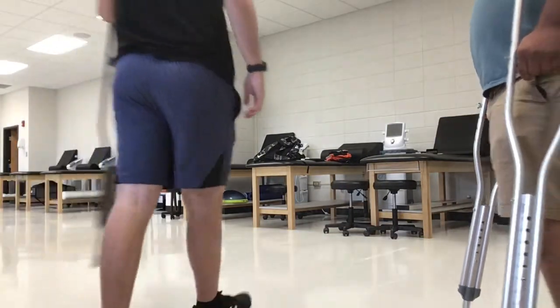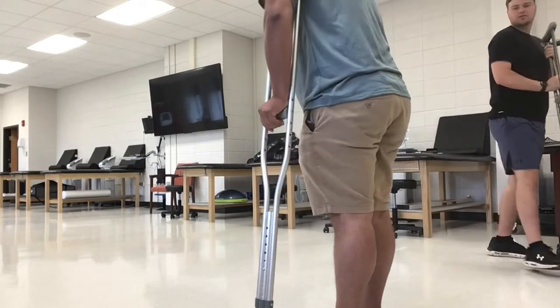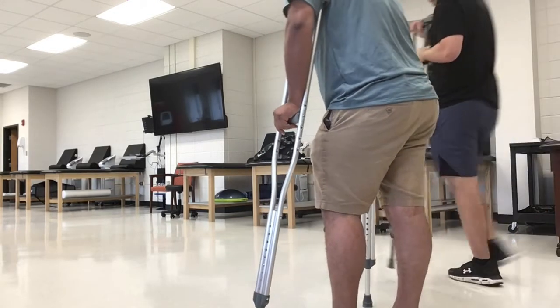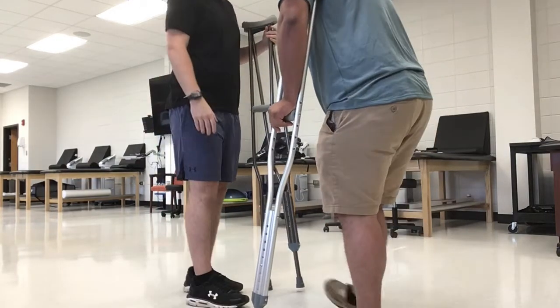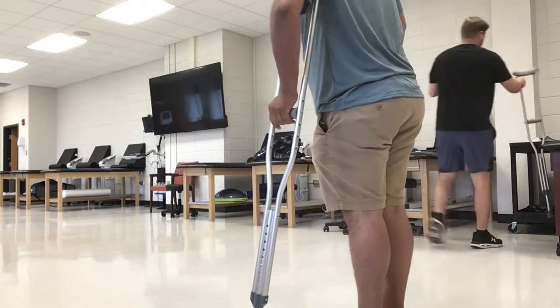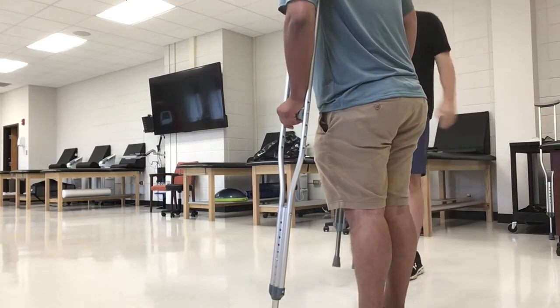All right, so on this one, have the camera a little bit lower to the ground. We're gonna have you walk with a single crutch, so you've gotten a little bit healthier. And so, which one was your right leg? So we are going to take away your right crutch, and now the left crutch is going to act as your weight bearing mechanism for the right leg.